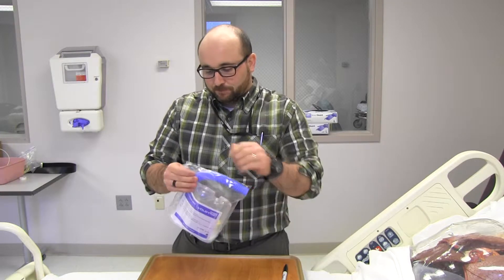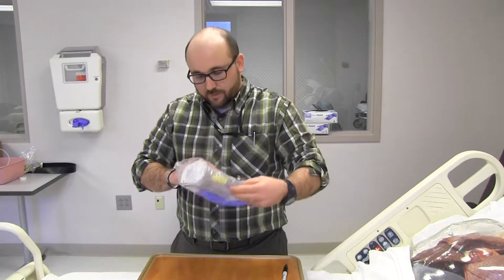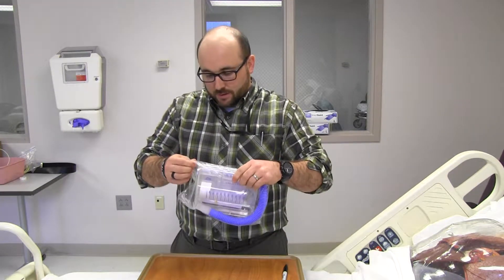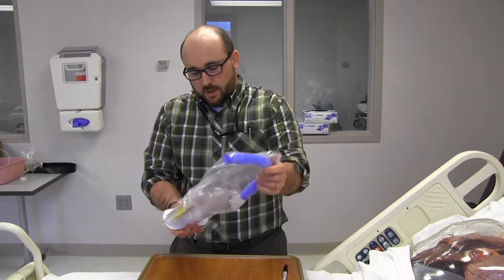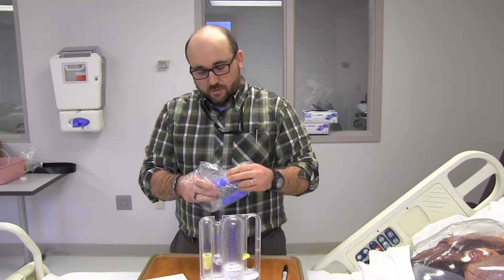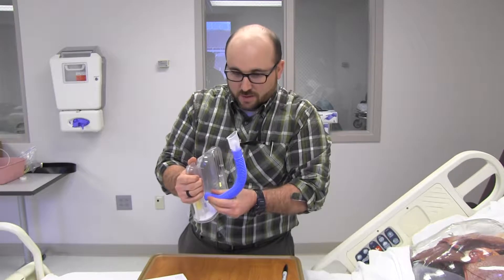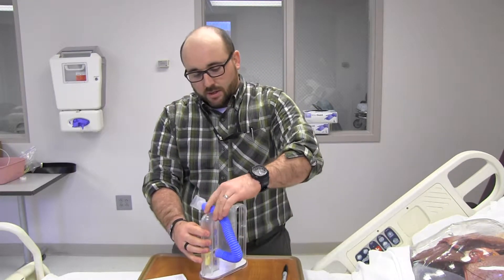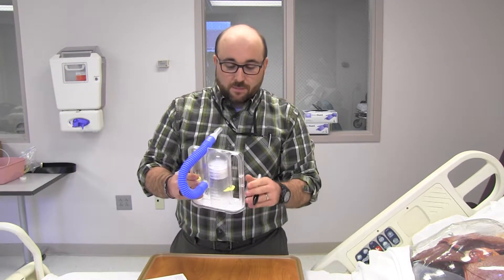I'll open it up. It opens up and has a couple of key pieces with it. We'll talk about this in just a second — don't throw that away, it's really important. And then we have the patient's interface here on this side. So here's your incentive spirometer set up. On the bottom, a lot of times it's nice because you can put the patient's name. It's a single patient use — we don't take these to sterilize them and reuse them. So single patient use, and we encourage them to take them home.